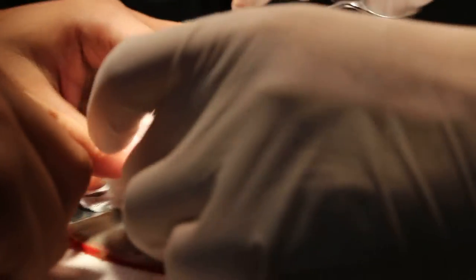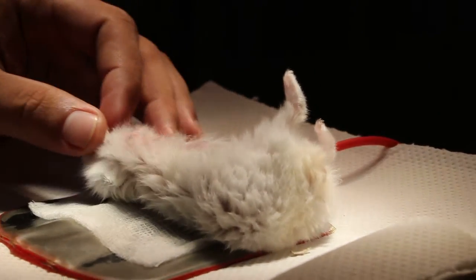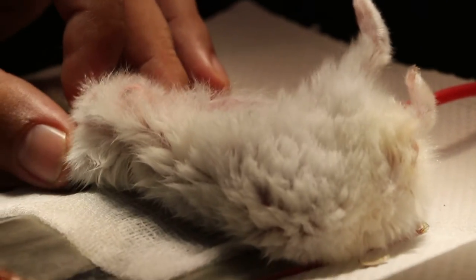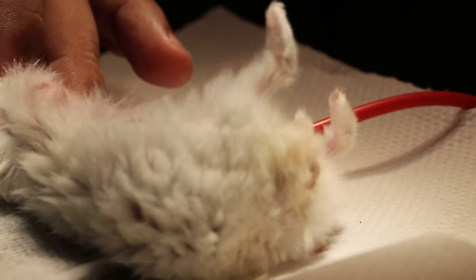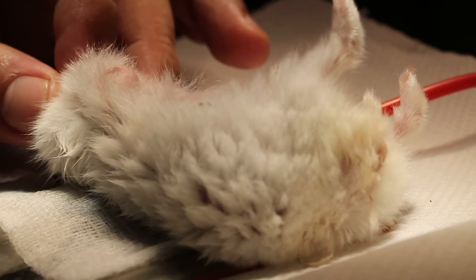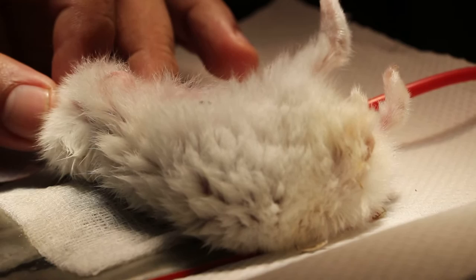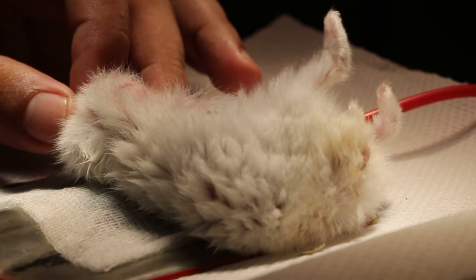Okay yeah, it looks more like abscess. If it is abscess, I'll just lance it. You just video it first. It is abscess, okay, ready.